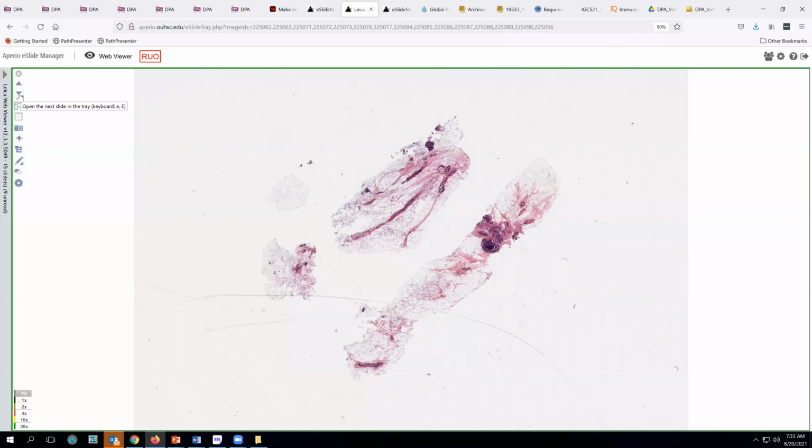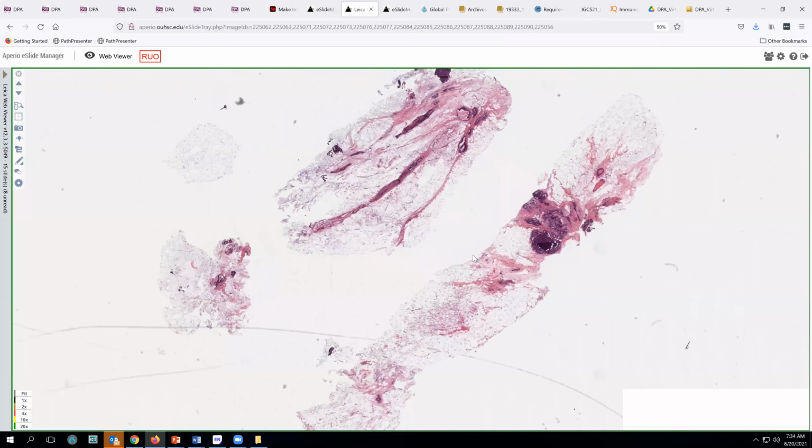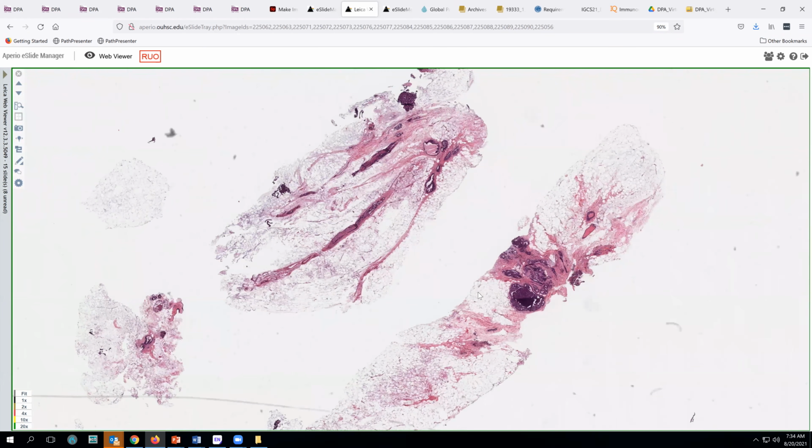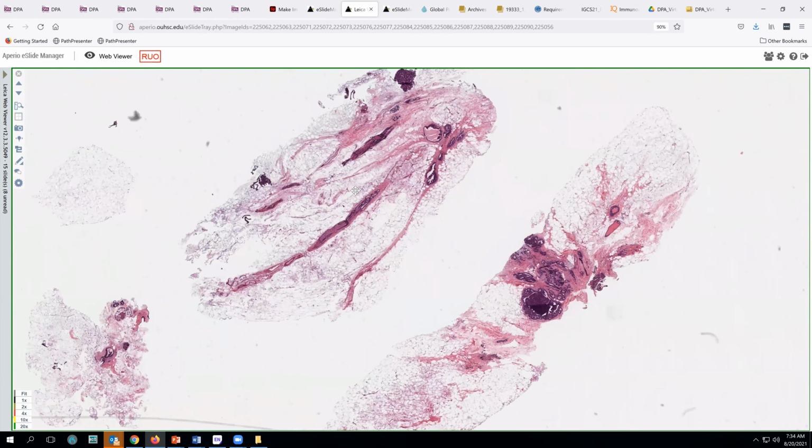So in contrast, sometimes we get biopsies where there's very minimal abnormality, but the patient has a history of, or a family history that suggests high risk for breast cancer. So this was a BI-RADS 4 lesion.